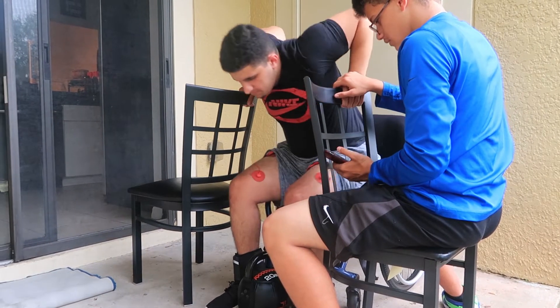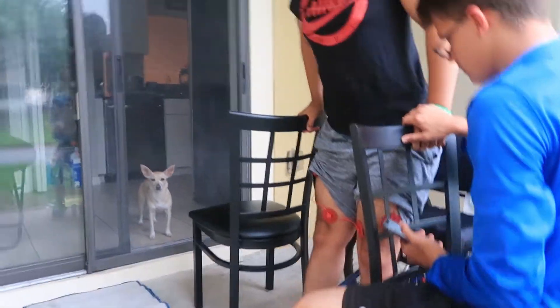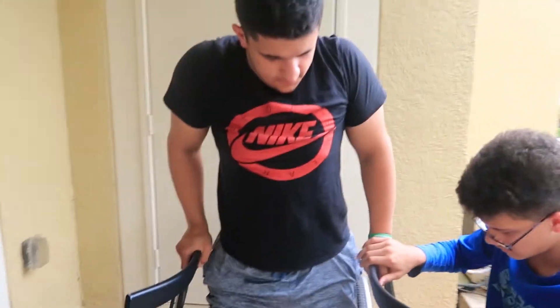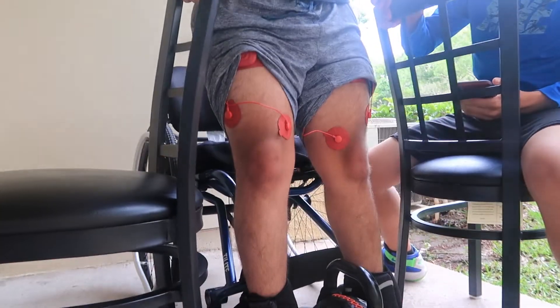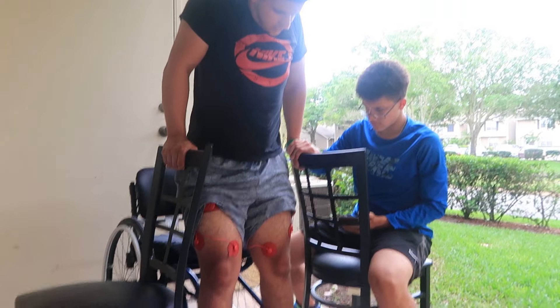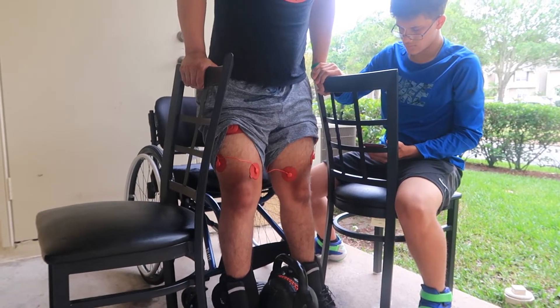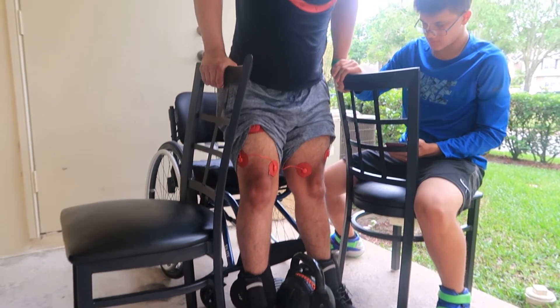Give it a little... and stay up, stay up. You got it. And it's off — see what happens when it turns off? My leg unlocked. It's turning back on in three, two, one. Good. See that? Yeah.